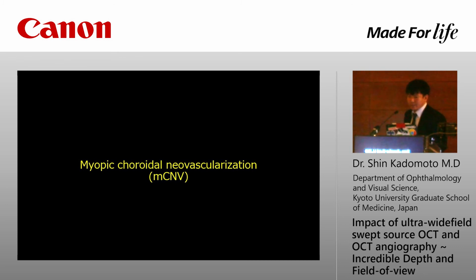The final case of this lecture is pathological myopic cases. This is a myopic CNV.